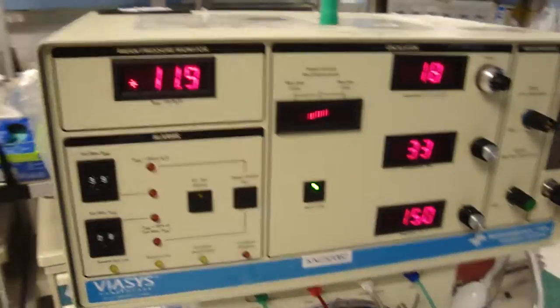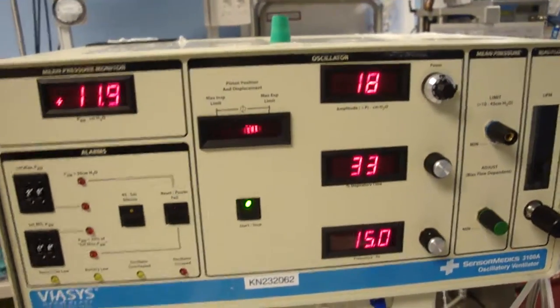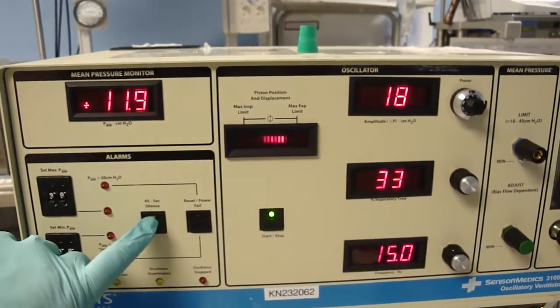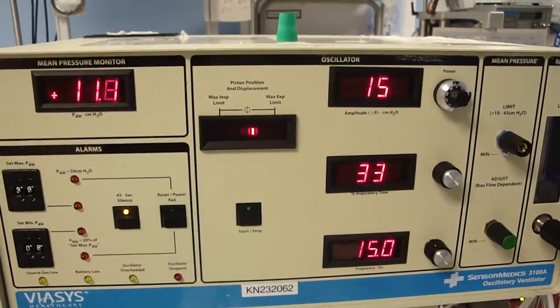When it's necessary to check either heart tones or bowel sounds, it is possible to stop the piston and make an assessment. First, silence the alarm and then stop the piston.